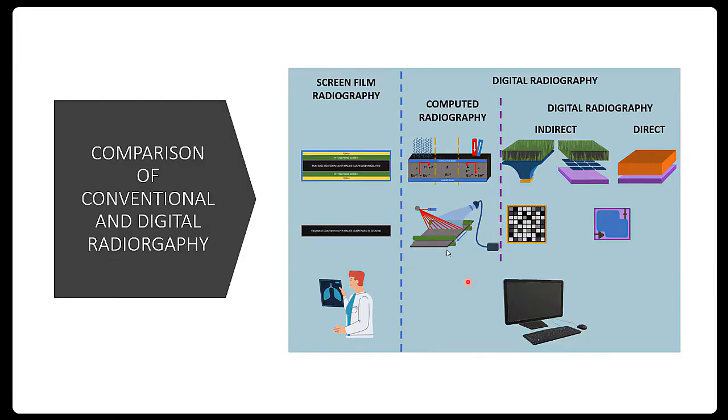Then PACS can accept any image that is in digital imaging and communications in medicine format. So we have a format in order to accept the image in a PACS. That is DICOM format. DICOM is the universally accepted format for a PACS system. So PACS will accept any image that is in DICOM format for which it is set up to receive, whether it is from cardiology, radiology, or pathology.